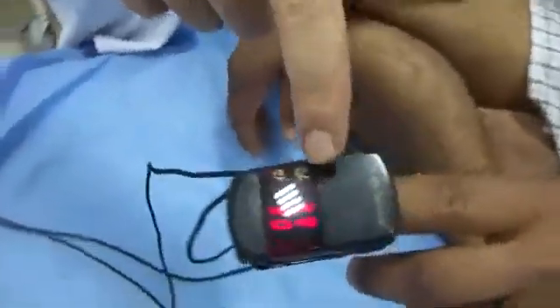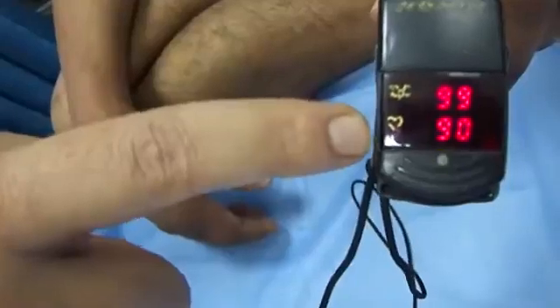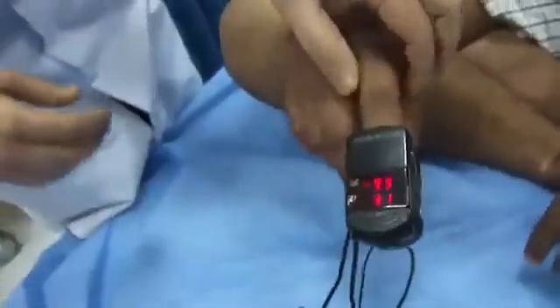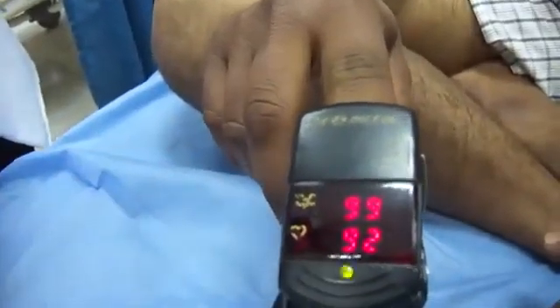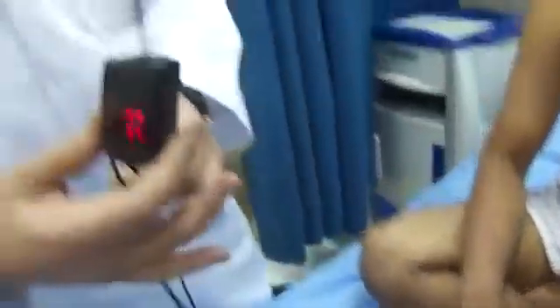The oxygen saturation of our volunteer is 99%. The pulse rate is 90. Then you have to check the contralateral side. On the other side, it is also 99%, and the pulse rate is now 92.